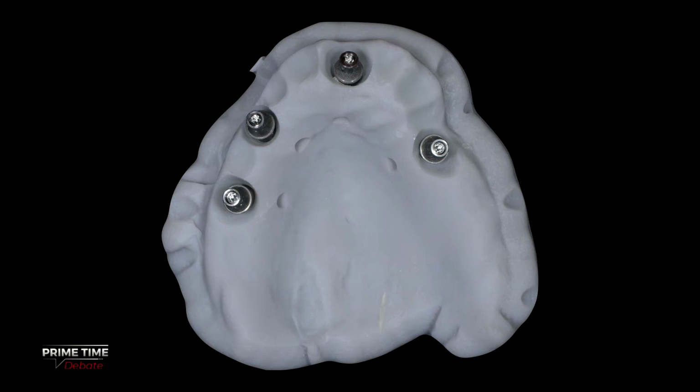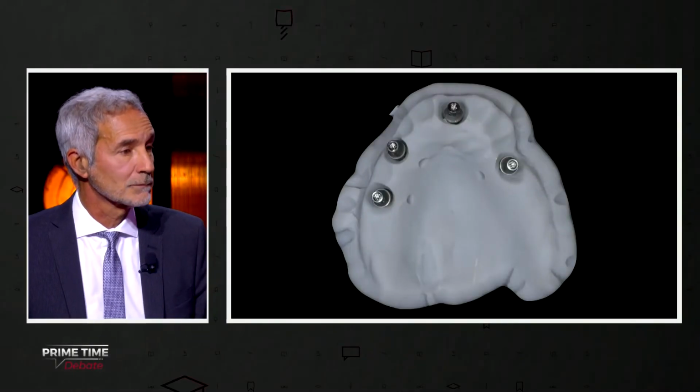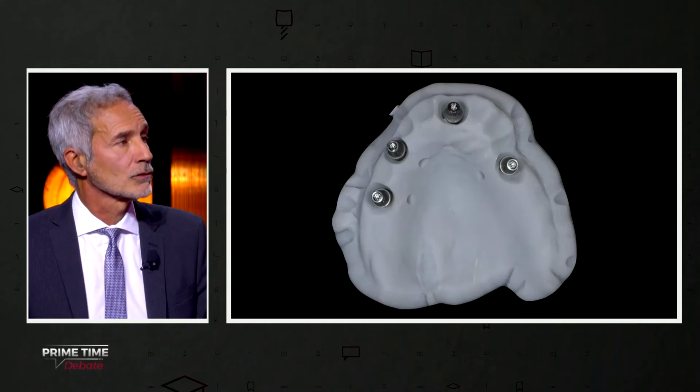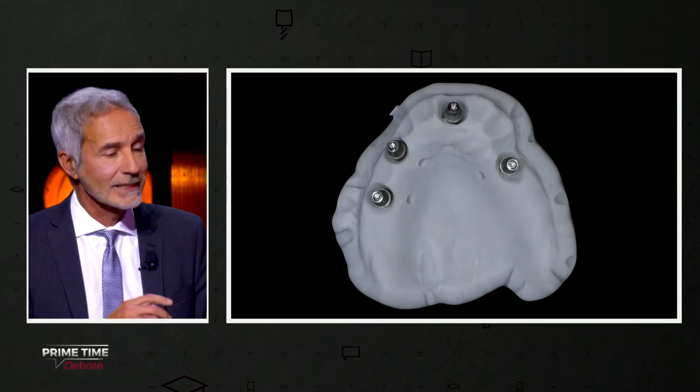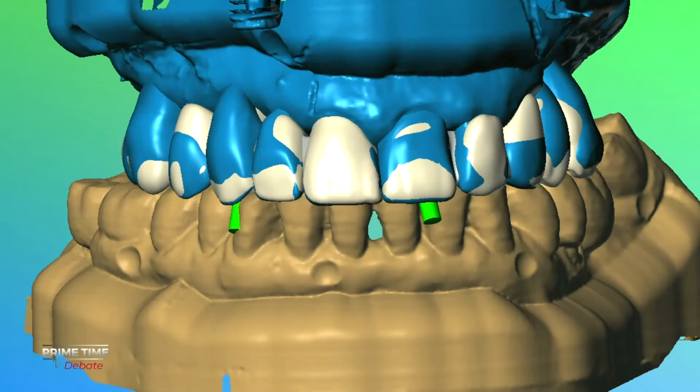So he has in hand all the data to produce a very nice provisional bridge, because on top of the implant, he placed the abutment that we have chosen on the computer. On top of that, we also placed the T-base, and then moving once again on the digital side, the setup is positioned on top of the model, and we can mill the provisional in accordance with the shape given by the setup.